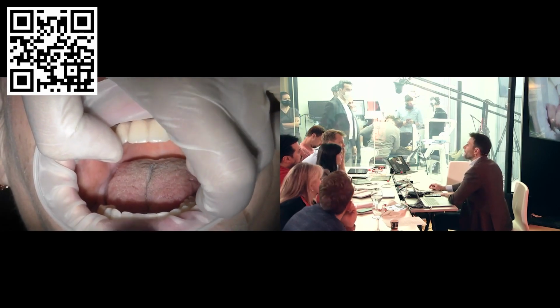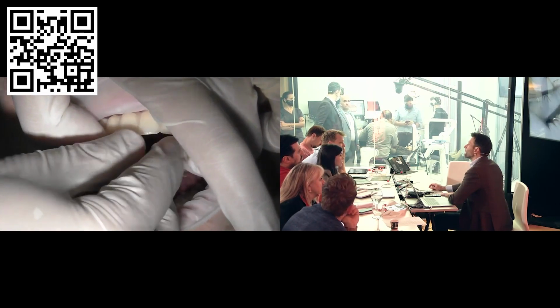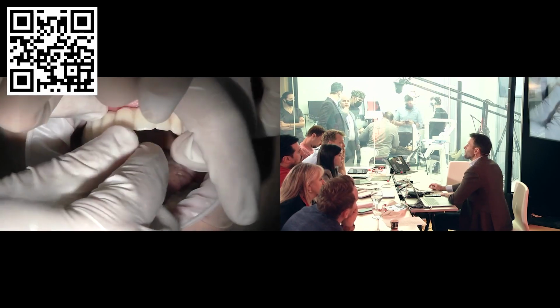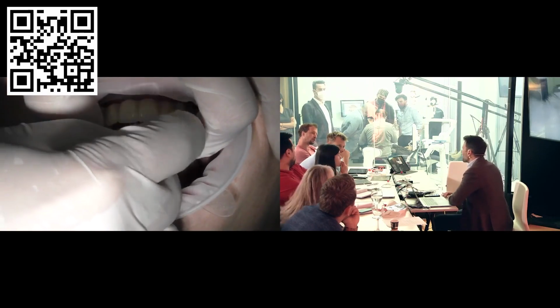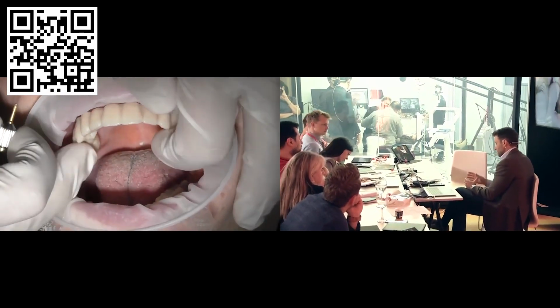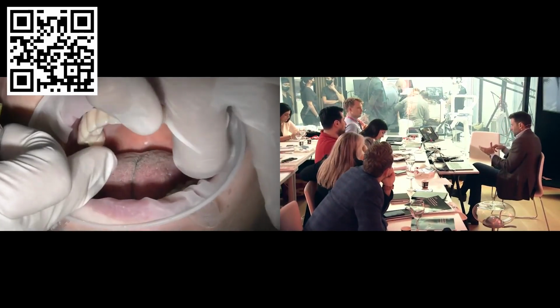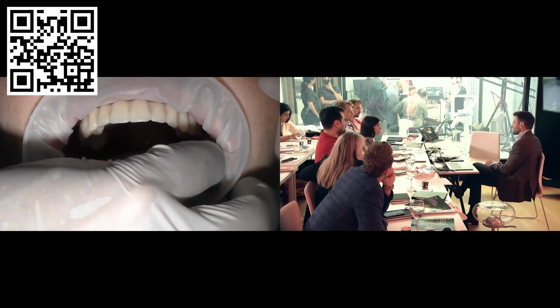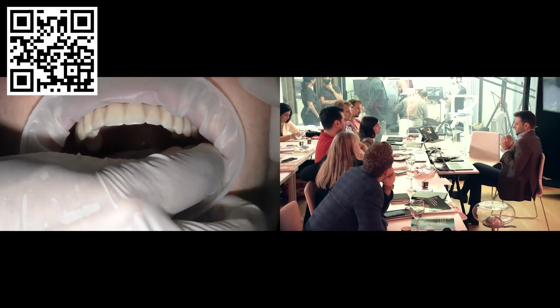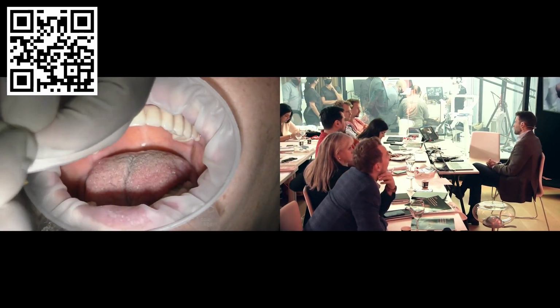The second thing, why did you scan the soft tissue with the abutments only in place and then with the scan abutments? Because the scan abutments also give you the tissue. So what is the sense? To get the shape of the gum, to design the... For any reason, let's say your multi-unit is deep and you developed an emergence profile and you want to capture that, then you need to scan without the scan bodies and then place the scan bodies. But when the multi-units are at the gum level, then you can scan in once.